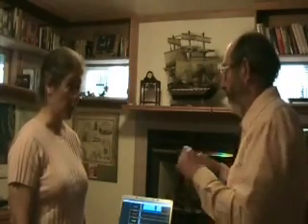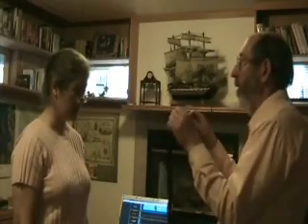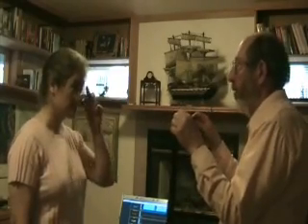And for you, it's up here, just above your breasts. For men, you record right at the nipple line. That works perfectly for virtually all men. For some women, you have to go below the breasts, or on it, or above them. So for you, we're going to go just at the top of your breasts, right under your armpits. Okay. And what I'm going to do is hand you this sensor so that you can hold it in place.